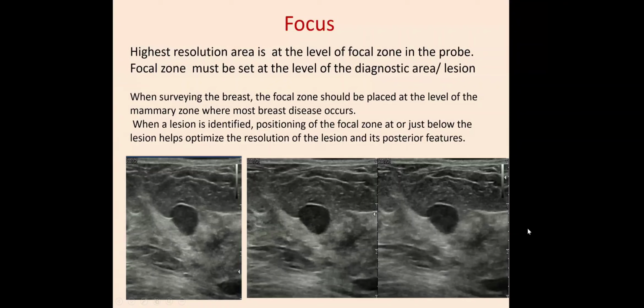So once you find the lesion, you put the focus at the site of the lesion. And if you have not seen any lesion yet and you're just scanning the breast, you put the focus at the mammary zone of the breast.